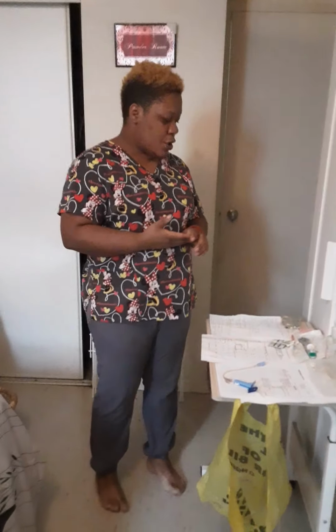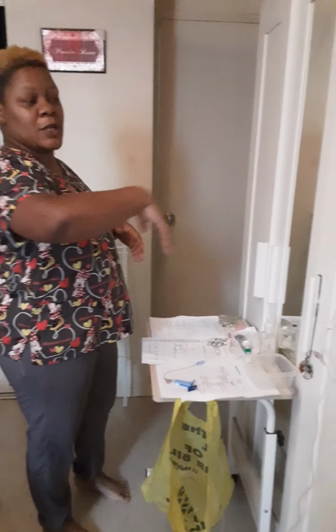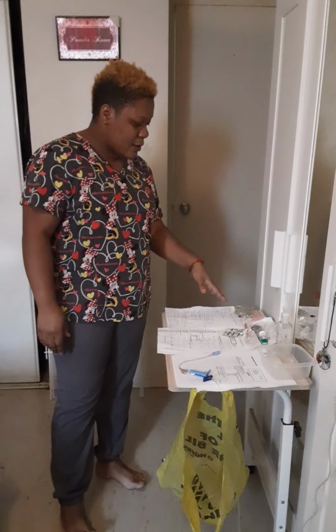My name is Melissa and I am a nursing student at Seneca College, and today I'm going to demonstrate how I'm going to prepare a piggyback infusion using a medication called pantoprazole. Before I begin, I have already hung my primary bag. I have my secondary bag available.